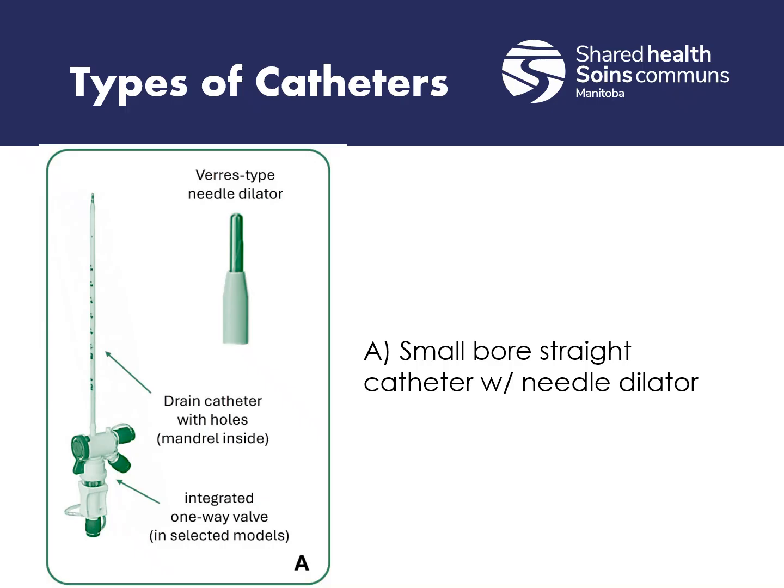Based on what the hospital determines is required, we may see different ones on the patients. Again, it's not something we're really going to make a decision on. It's just good to be aware of the different sizes. So we've got the first one here. This is a straight catheter, a simple direct tube, often used for fluid.